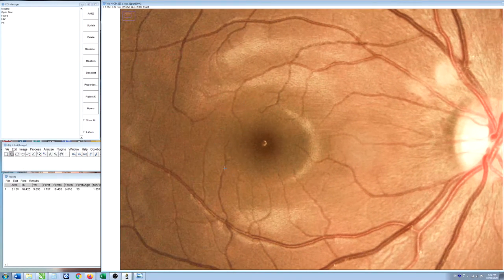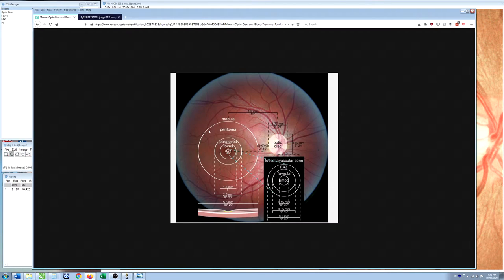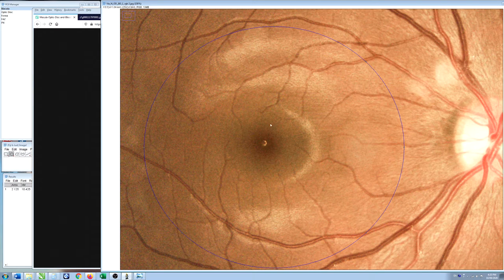Coming over to the macula — this larger central part of the eye is where detailed vision is added. The macula in humans is about 5.5 millimeters in diameter, so it's quite a large structure. On our image, this structure delineated by the blue circle is the macula — measuring about 5.2 millimeters in diameter here.